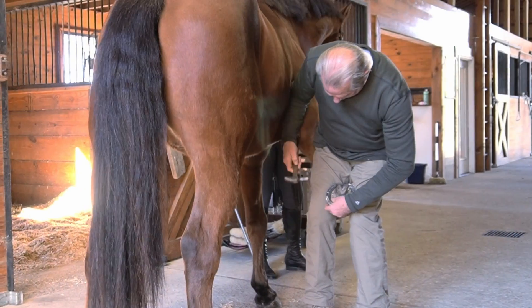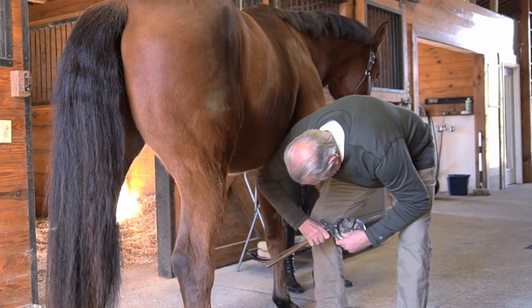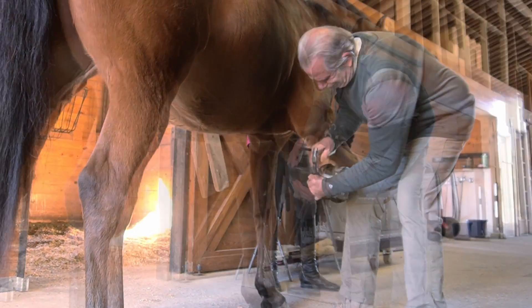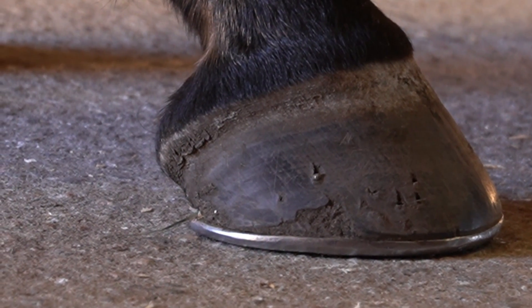One tip that can make the casting process easier is to either pull up one of the back nail clinches or drive a new nail in the back nail hole. Cut it off, but don't clinch it. This will act as an anchor to help get the casting process started.